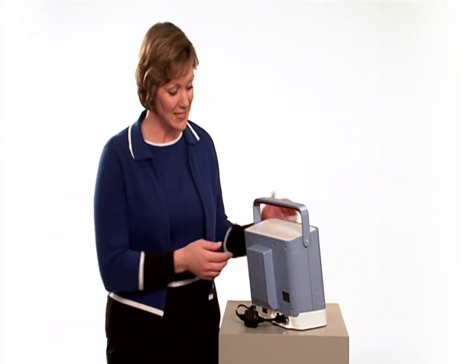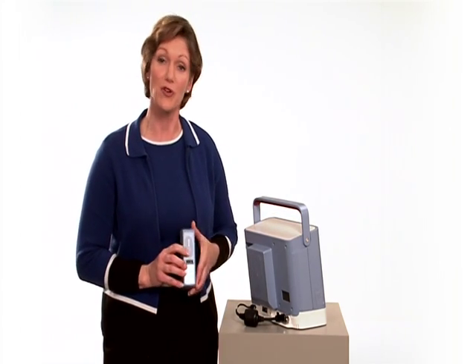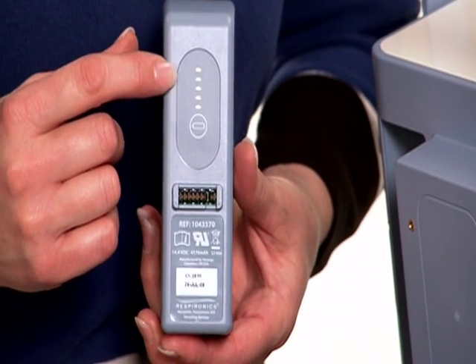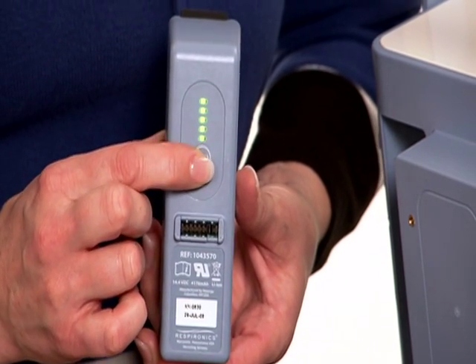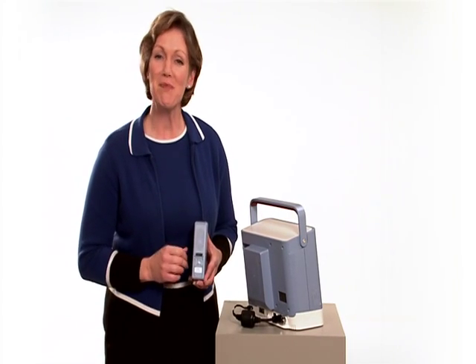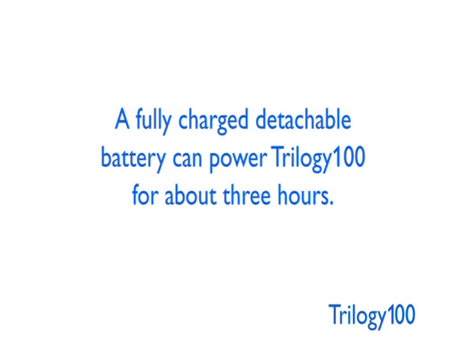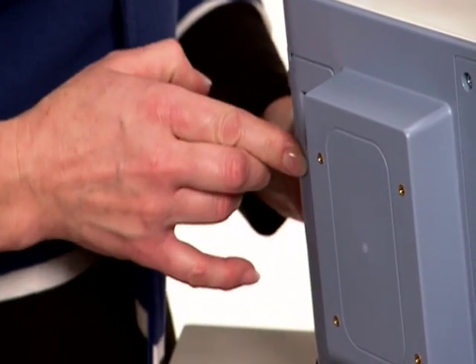Trilogy100 also features a detachable battery pack. When the device isn't connected to an AC source or an external battery, this will supply the power. Here on the back of the detachable battery, you can see a set of LEDs. Press the button below to see how much charge is left in the battery. When all the LEDs are lit, the battery is 80 to 100% full. Under typical conditions, a new fully charged detachable battery can power Trilogy100 for about 3 hours. The detachable battery snaps easily back into place on the back of the ventilator.